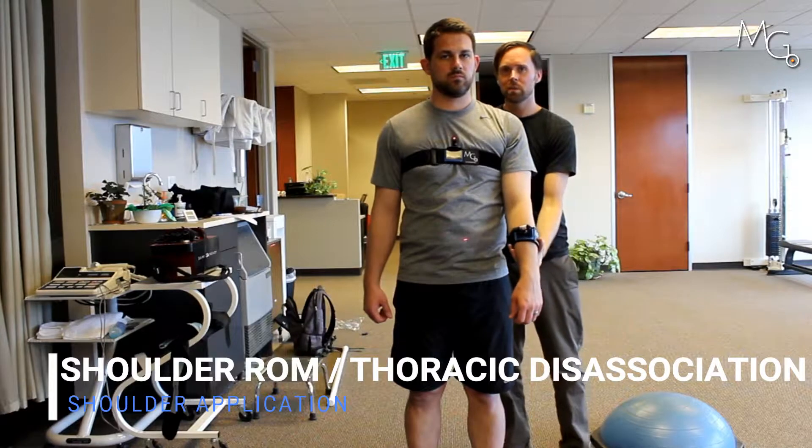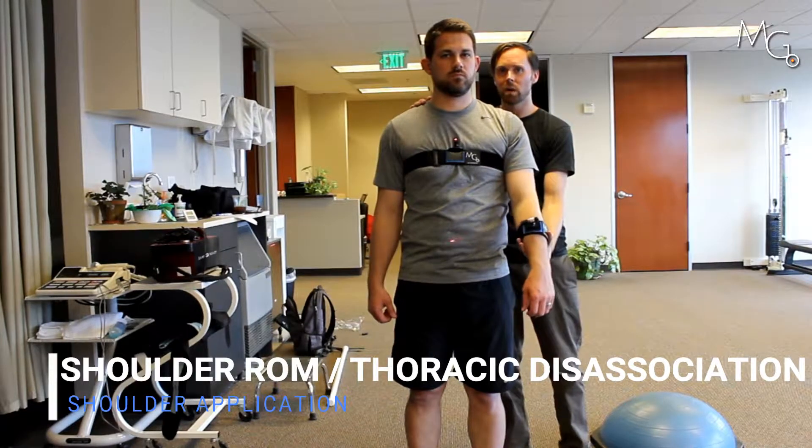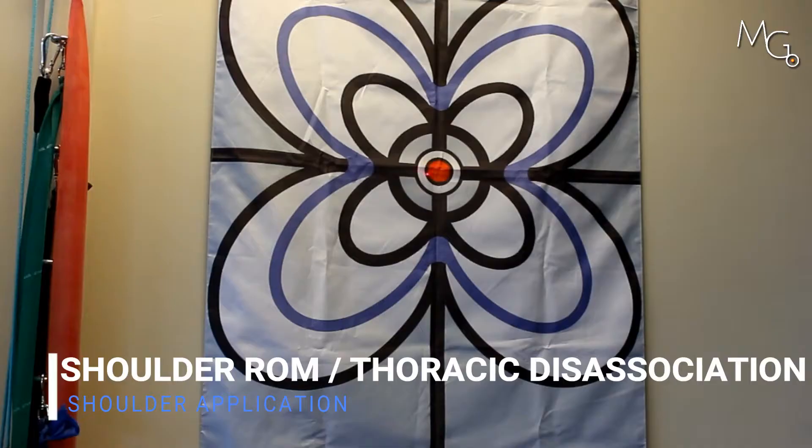What I'm going to cue him to do is keep the laser centered, which he can see right now. He's going to bring his arm up in the same position, all the way up, and back down. Go ahead and do that a few times, trying to keep the center laser still as you move that arm up.